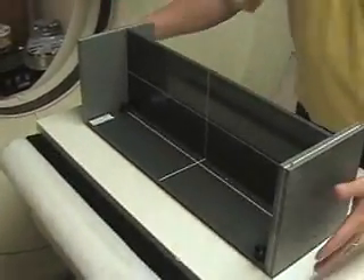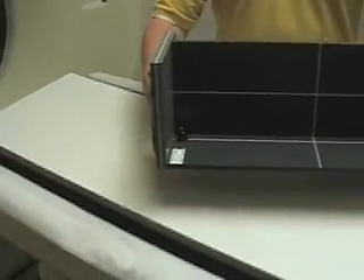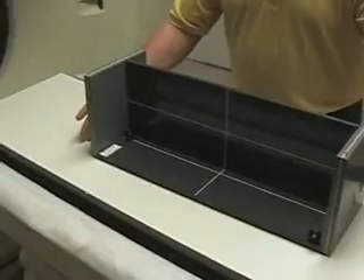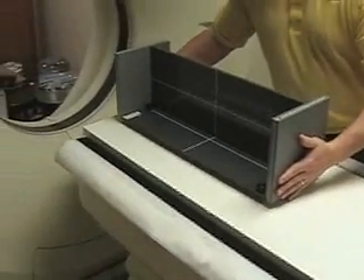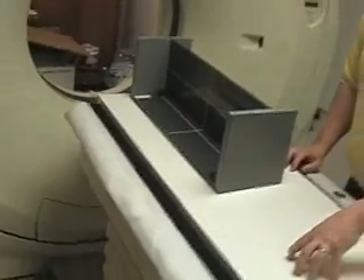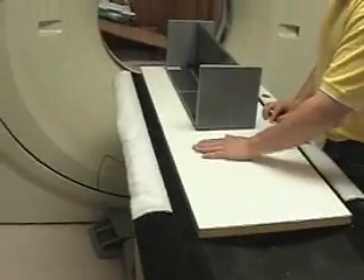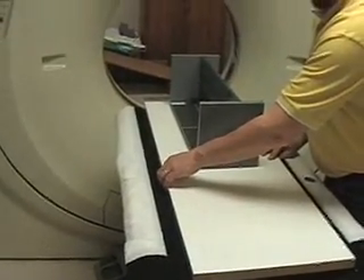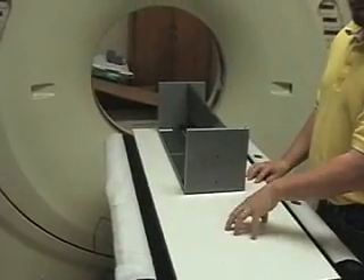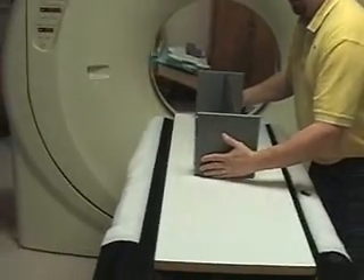To position a phantom — wherever it's stored, in the box or on the counter — when you take it out, first put it on the couch. You need to have a flat surface, usually a board that fits the table, or any flat level board. Put it on the counter or the couch and level it, then put the phantom on.